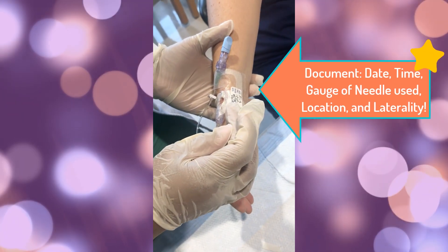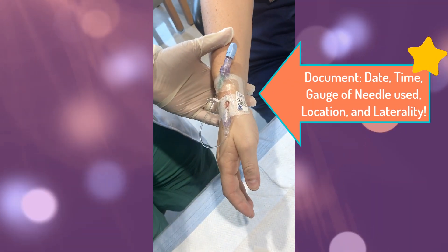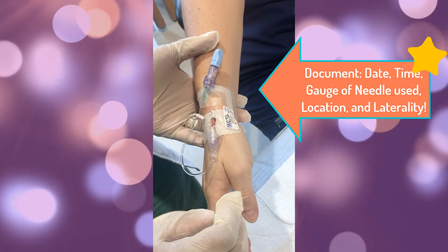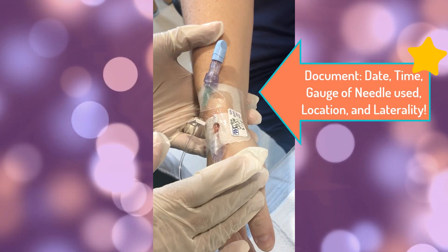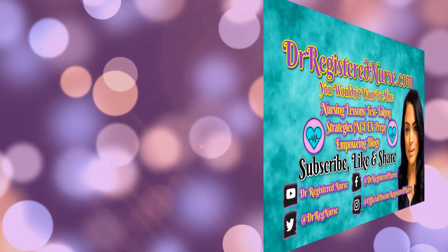Proceed to date, time, initial, and place the gauge number used on the patient label. Once the IV site has been labeled with the date, time, gauge, and your initials, document this in the patient's medical record, including the location of the IV site — for example, this is the right wrist. Here is the completed IV site.